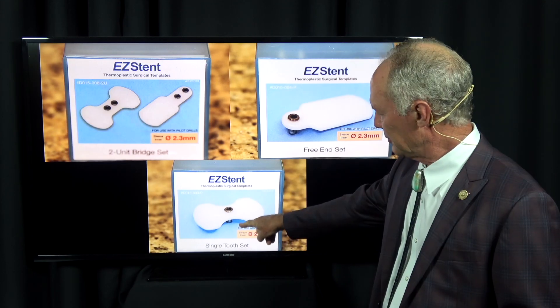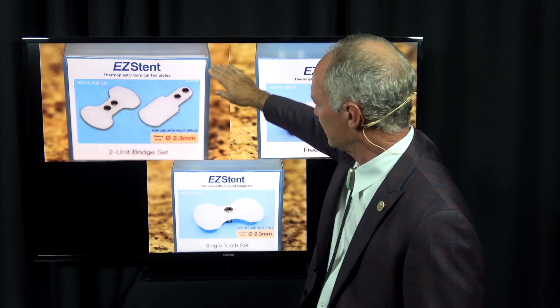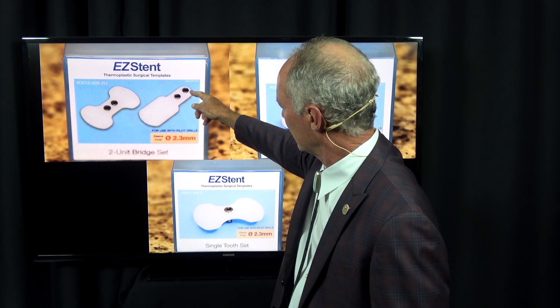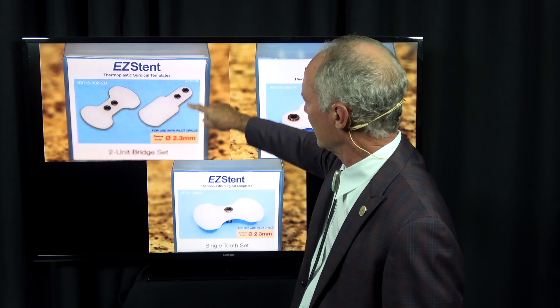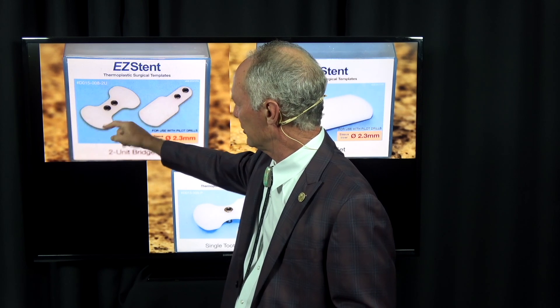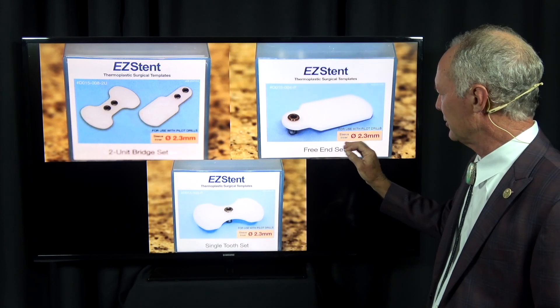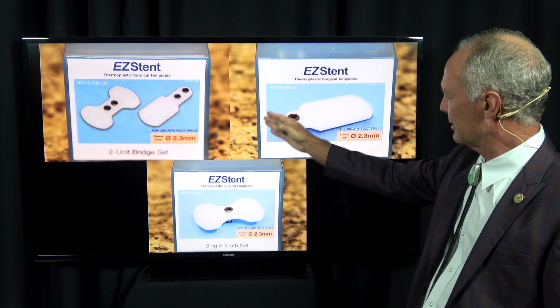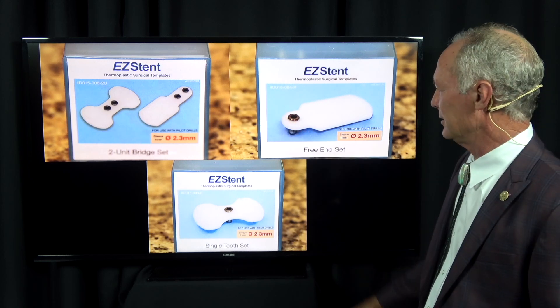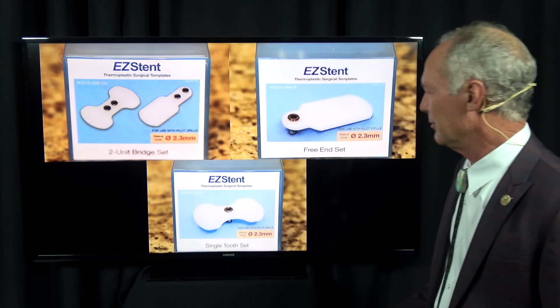There's one for a tooth being replaced between adjacent teeth, one for when you have a distal or mesial extension with no posterior teeth to connect to — placing it on teeth adjacent to the edentulous area. There's also a version for when you're missing two teeth, and one for a single missing tooth with no teeth distal or mesial. These accommodate different edentulous situations with ideal spacing between implants.